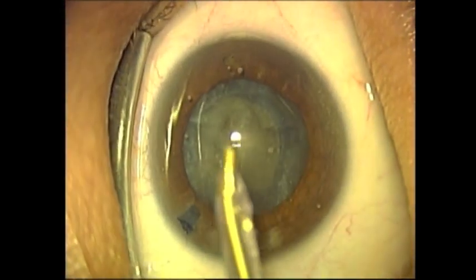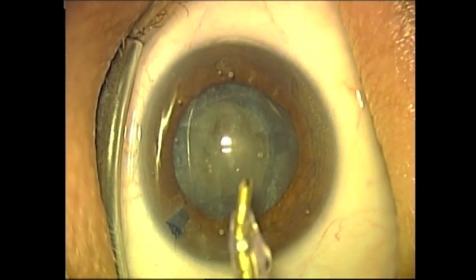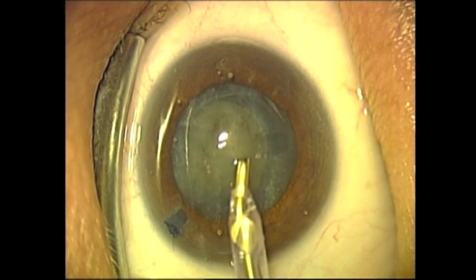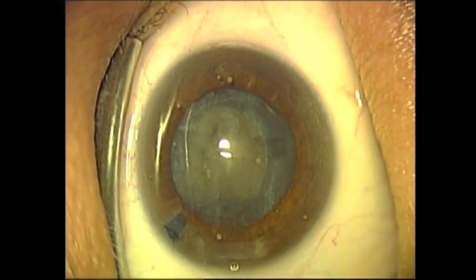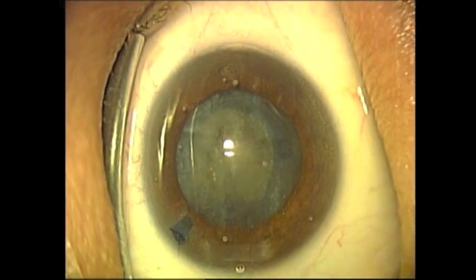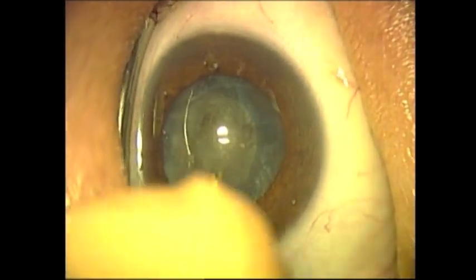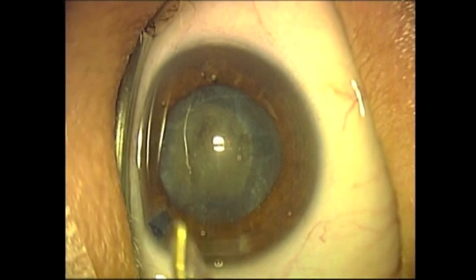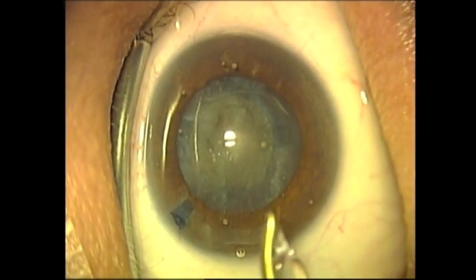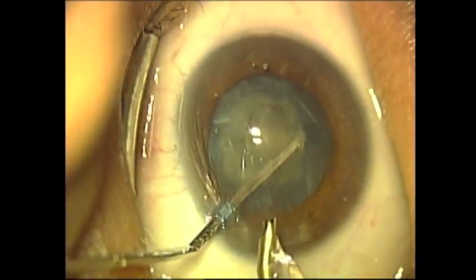This film will only demonstrate the phacoemulsification portion of the procedure. Cortical cleanup and intraocular lens implantation will not be demonstrated in this video. The tubing is rotated such that the irrigation is flowing away from the corneal surface.